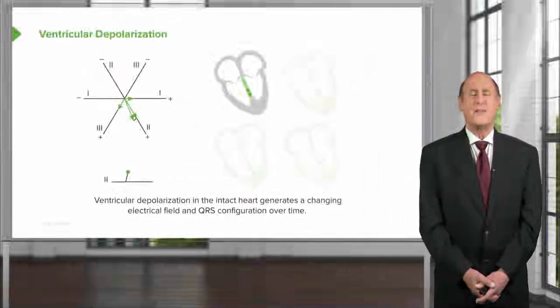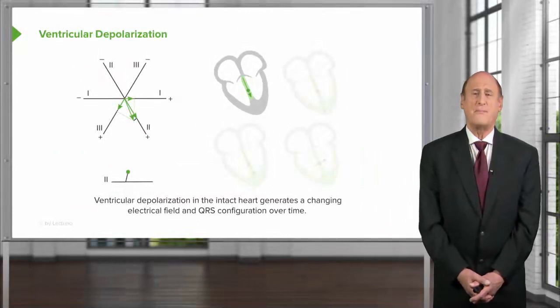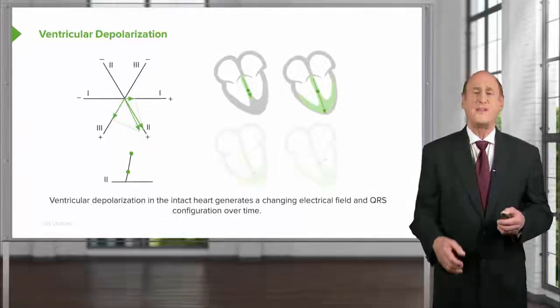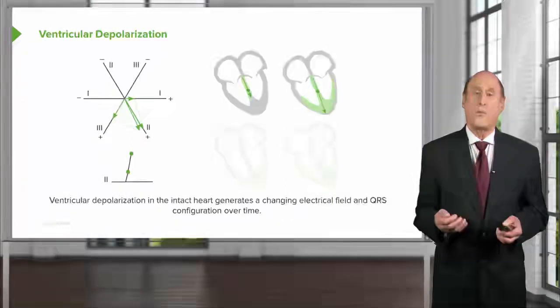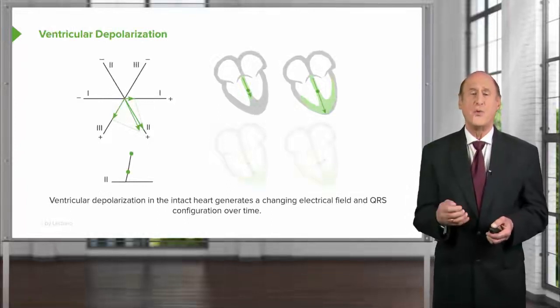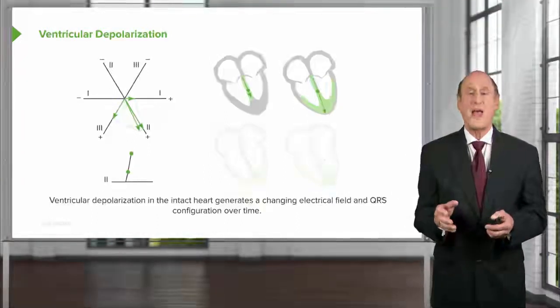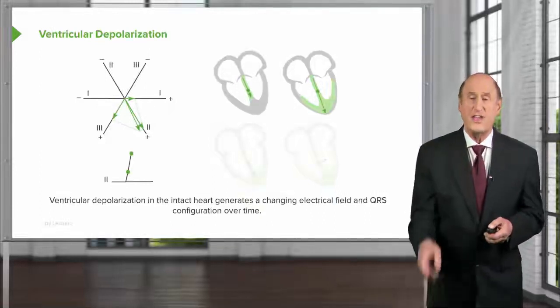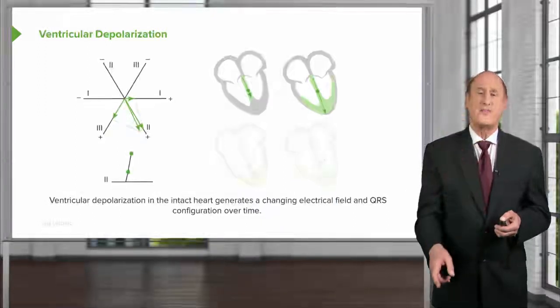It's interesting that the wave of depolarization doesn't go through the ventricle all at the same place. It comes down the septum, arrives at the apex, and then turns back and does the base. So what that means is that if you're an observer, an electrode watching this, when the wave of depolarization is coming towards you, the EKG records an upstroke. When the electrical depolarization passes the apex and starts to go back towards the base, in other words, going away from an electrode, you see a negative deflection. And that's why, for example, on the QRS, there's some positive and there's some negative.